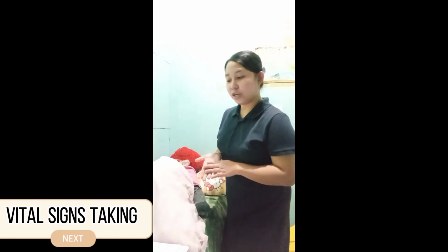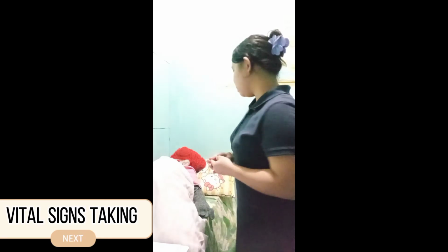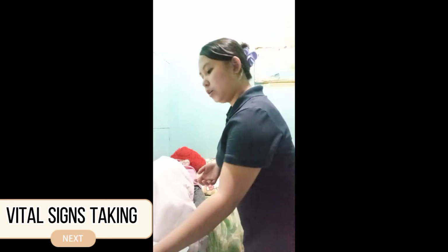After asking some questions, evaluate the estimated date of confinement and the age of gestation using Naegele's rule. So now, I will be getting her vital signs. Vital signs are an essential part of care for the patient, where we monitor their medical problems by taking blood pressure, respiration rate, pulse rate, and temperature. Since we already identified our client, we now explain to them the procedure and assess their physical condition. Make sure that they rest before we get their blood pressure. So, Miss Bear, I'm going to take your blood pressure for now.